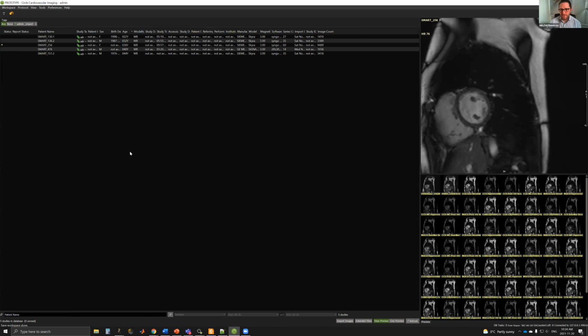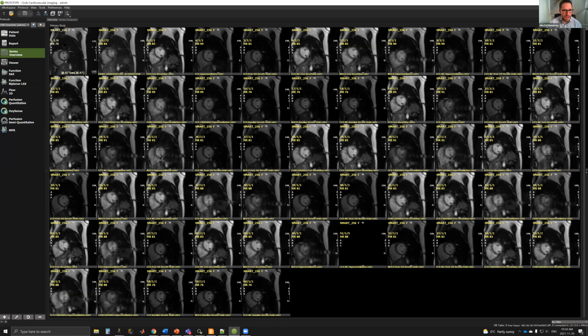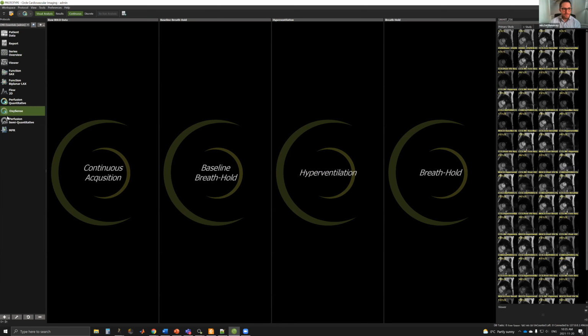So I'm in CVI 42 here. This is our prototype build with the module. And here you see the patient list as usual. I'm just going to select this patient here. It's the standard CVI 42 interface, except we have this OxySense module here. This is a working title, probably change it to something else, but nonetheless, this is the module that is used for analyzing the OS data.